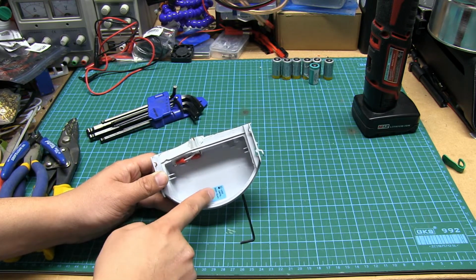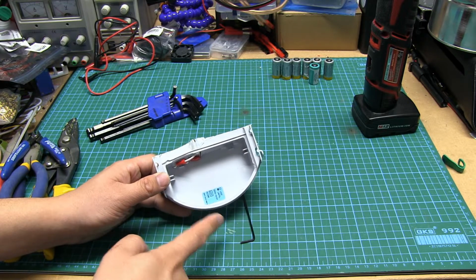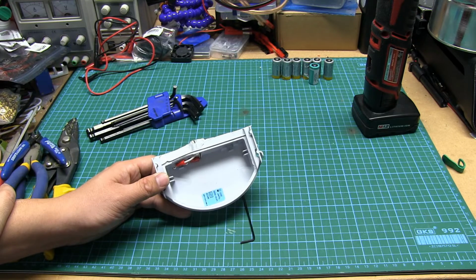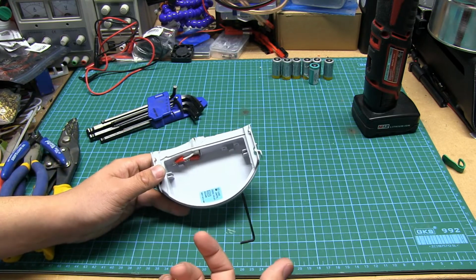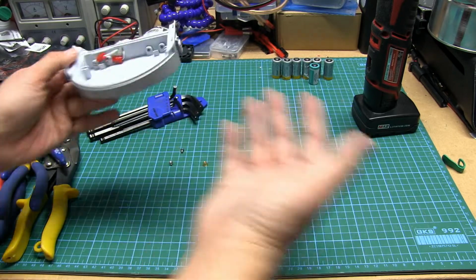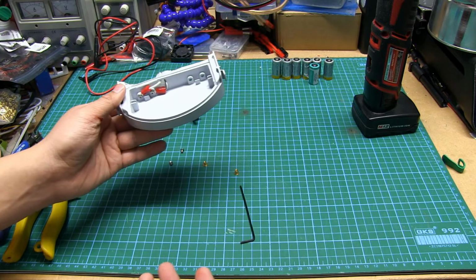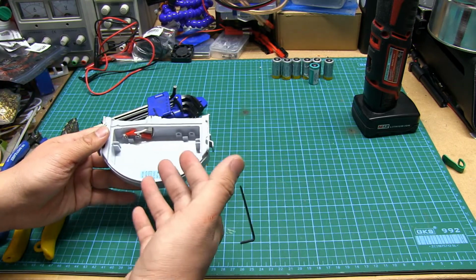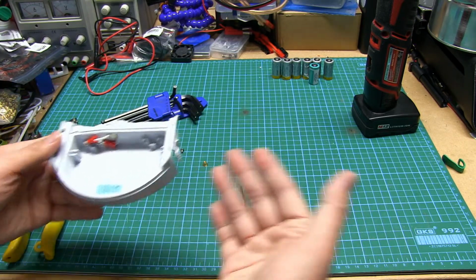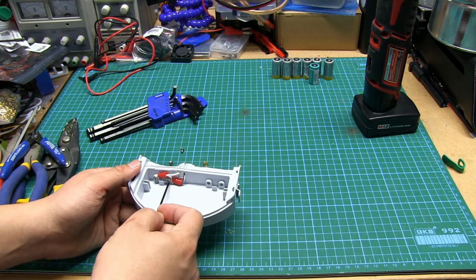pads with sufficient life. Otherwise, you end up with scenarios where potentially the battery has plenty of life, where the pads are about to expire, or vice versa. You would have two different sets of components. One has one shelf life, the other has another shelf life. So unless you assemble them together and take the shortest shelf life, you may end up with a bad component on the shelf in storage.